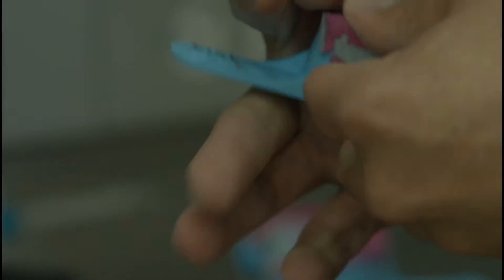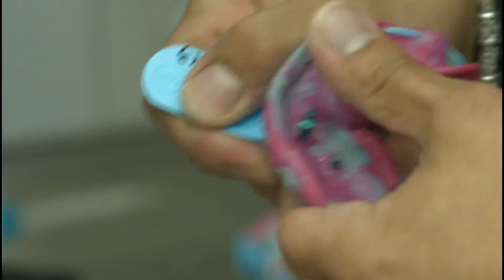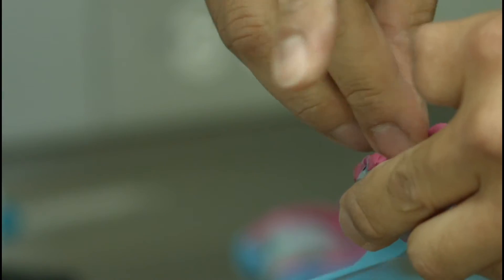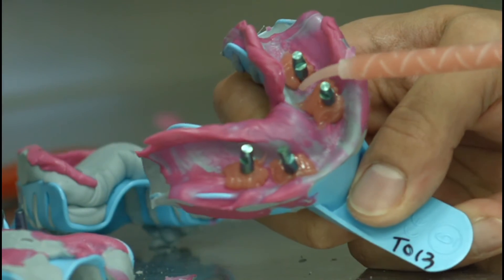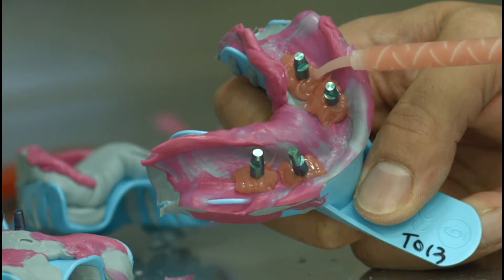Eight color-coded impression posts and corresponding implant analogs were assembled and inserted into the acrylic impression sleeves within the full-arch impressions. A separating medium was applied prior to the injection of a soft tissue moulage around the impression posts to simulate mucosa over the implants.